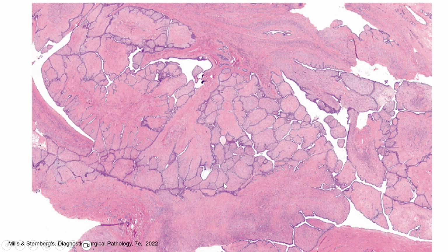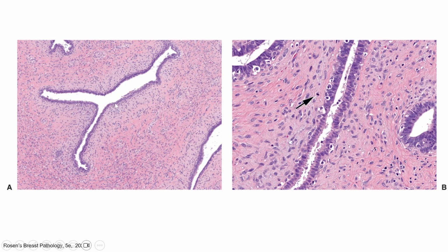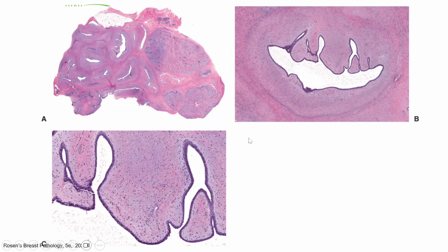So for benign phyllodes, subepithelial condensation, you can see more cells just surrounding the epithelial. And then there is the mitosis I wanted to show you. If you want to see my mitotic figure, just search around this area close to the epithelial component. So this is a low power for a phyllodes, this leaf-like structure.